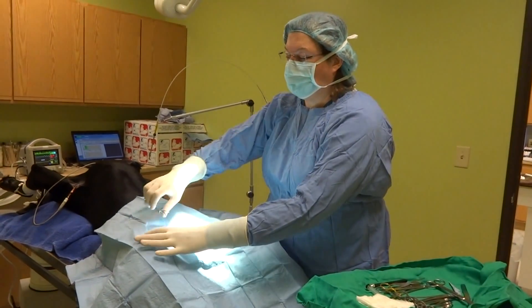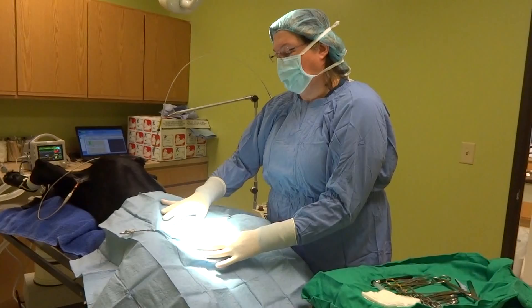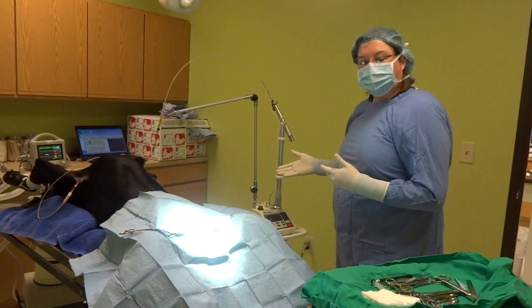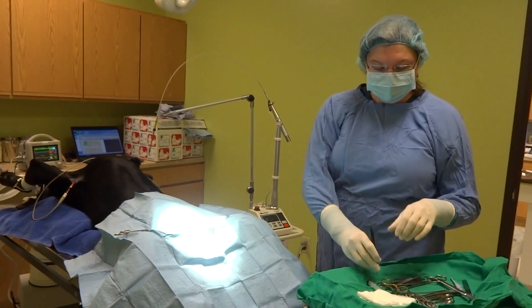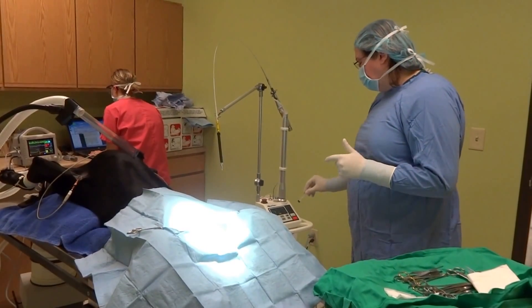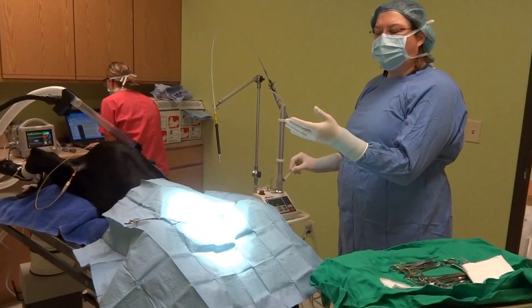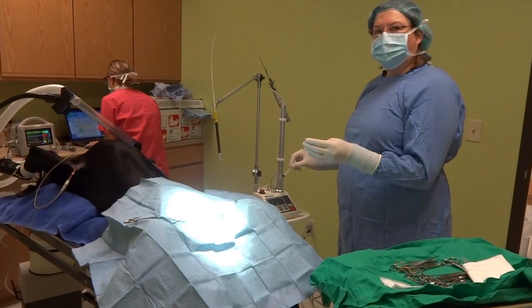Today we are going to neuter Moose. Moose is about an eight month old black lab and we're going to be using our surgical laser. We have a sterile handpiece and we have our laser set. I'm going to go ahead and turn the laser on and then we'll be turning the vacuum on to make our incision.